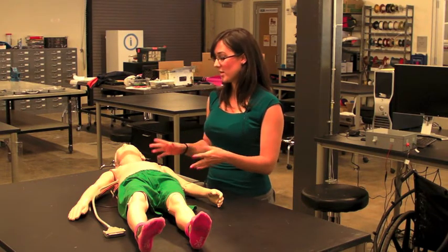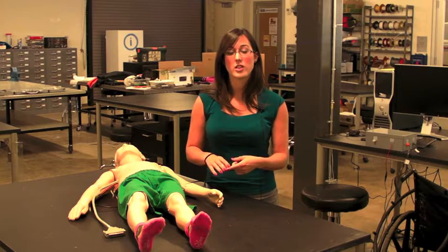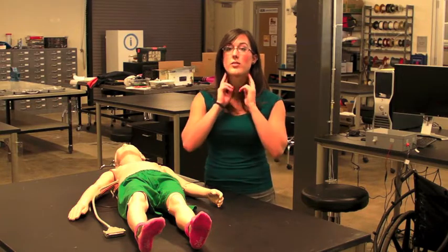This mannequin simulates an enlarged liver, spleen, and lymph nodes in the neck.